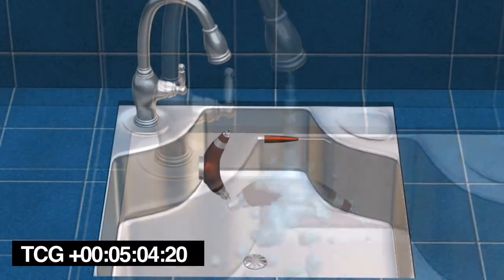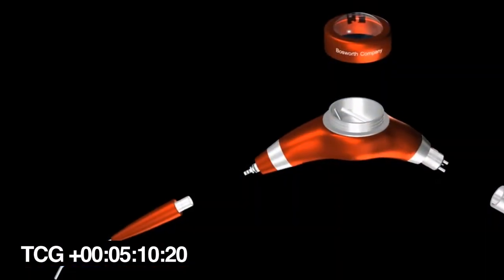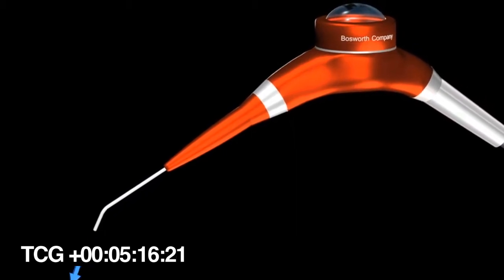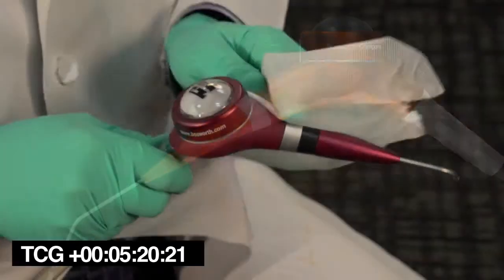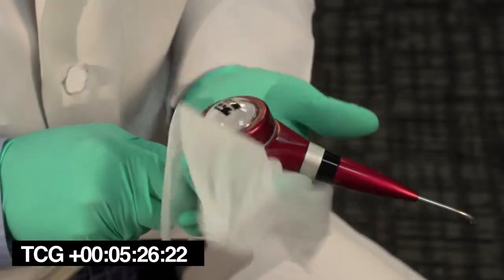Rinse the entire unit thoroughly with hot water inside and out, including the powder reservoir. Then reassemble the unit and with air only, blow out the air polisher, making sure that all the ports and nozzles are completely clear and dry. Wipe the air polisher body with a disinfectant wipe. Never autoclave the main body of the unit.